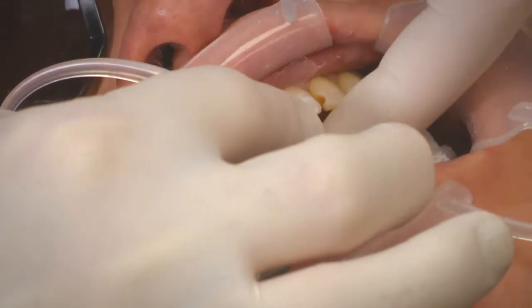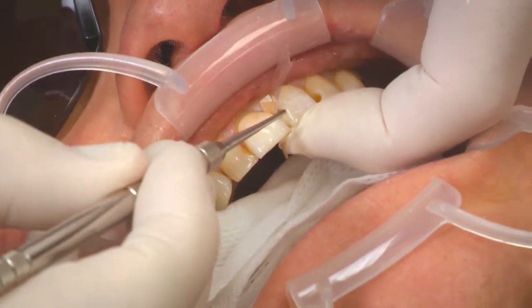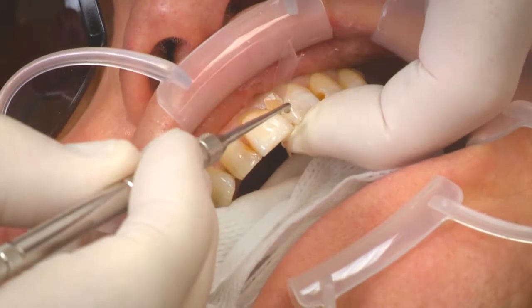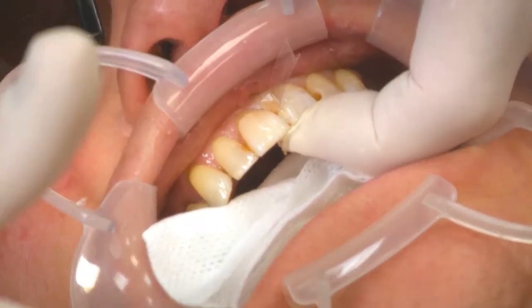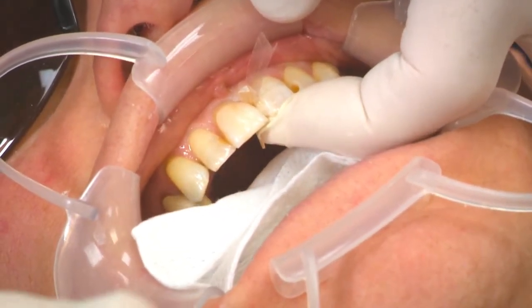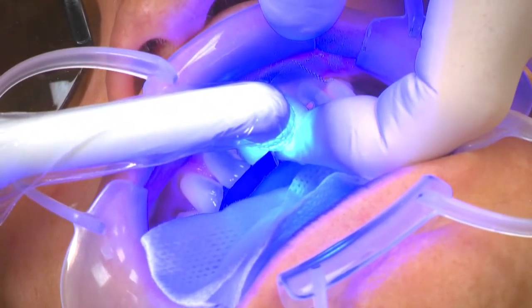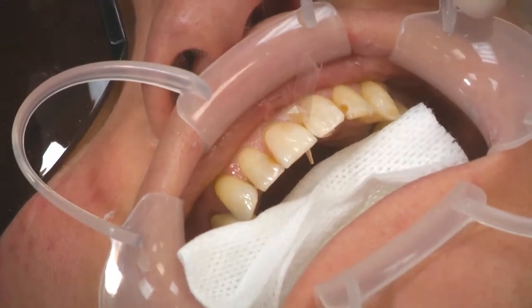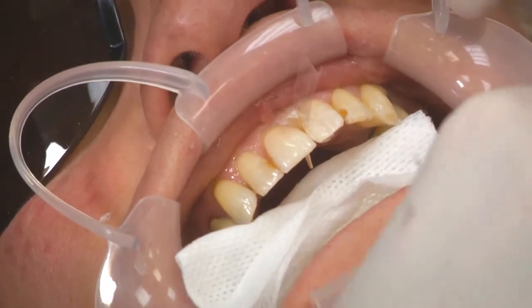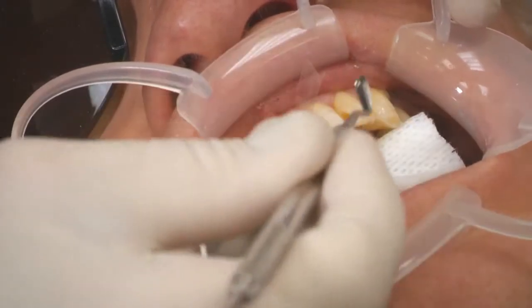Providing room for our enamel zones, curing is carried out for 20 seconds. For darker colours we'd cure for 40 seconds, but for lighter colours — up to DC3 or just DC4 — 20 seconds is sufficient. Now we apply the layers of enamel E3 to create the blend through the bevel zone.